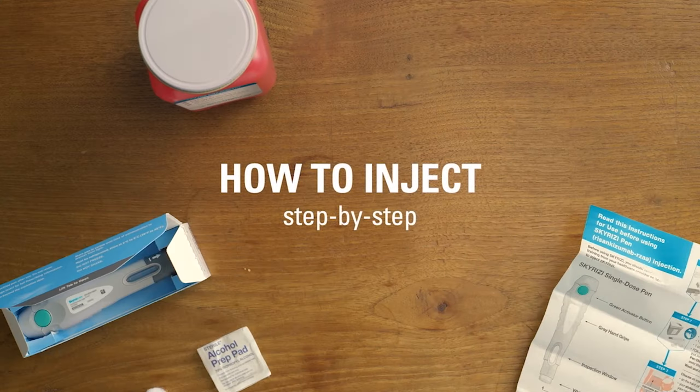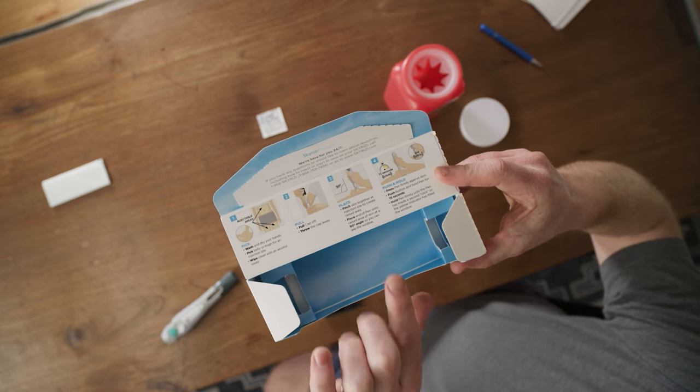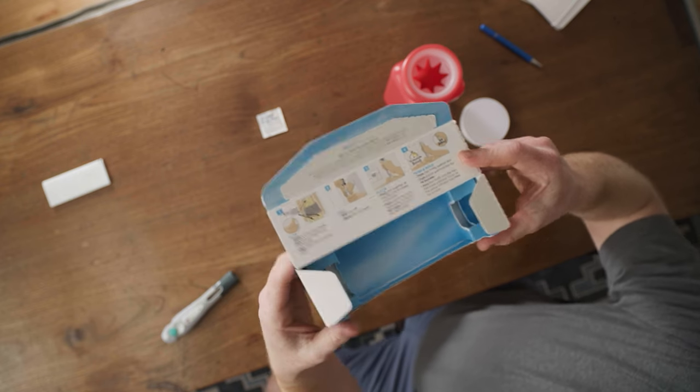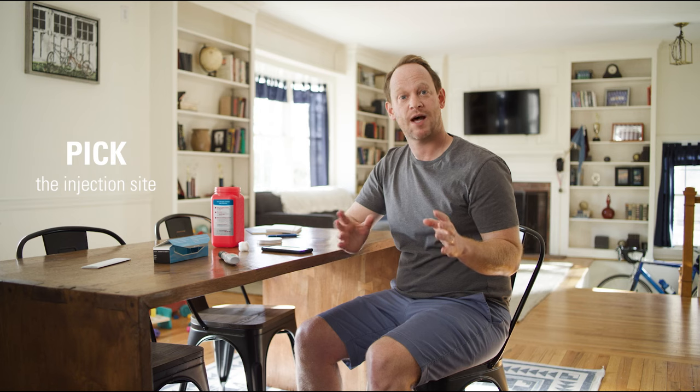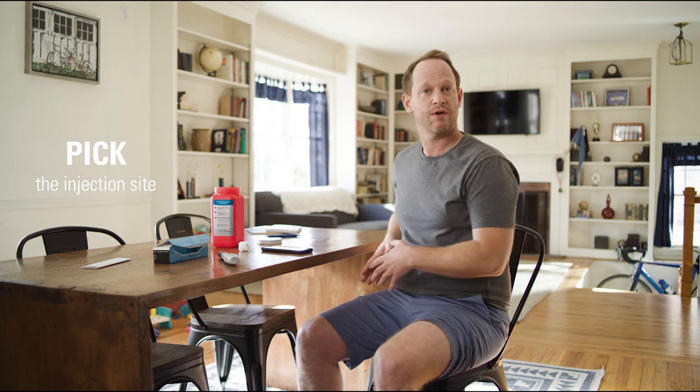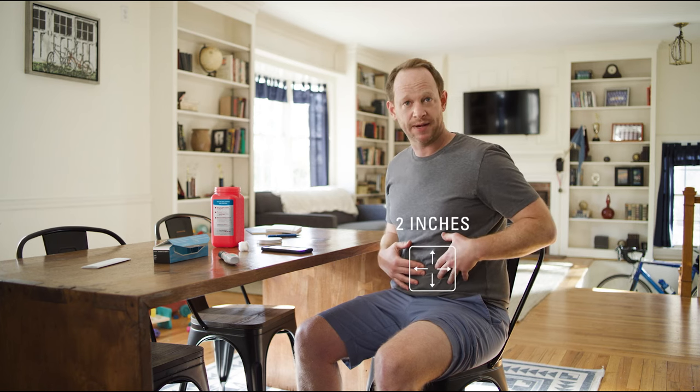I like to think about the injection process like this: pick, pull, place, push, and press. First, I'll pick my injection site. I'm going to go with my left thigh, but you can also inject into your stomach or your other thigh. If you choose your stomach, make sure that you inject at least two inches away from your belly button.